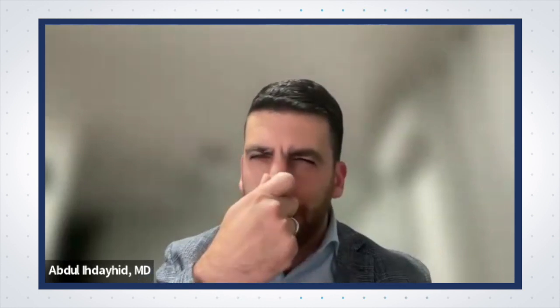To your second point about routine practice, without going too much into the results, which we hope to share later this year, we've been really reassured with the safety overall with giving GTN. We have taken a conservative approach for the study. The study excluded those with critical aortic stenosis. We felt that those with really critical hemodynamics, we don't want to push the boundary too far just yet, so we avoided giving GTN to those patients.